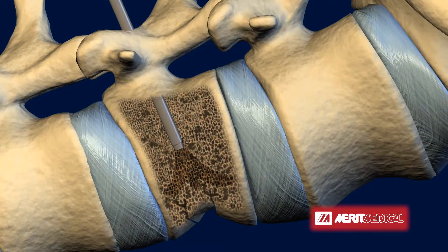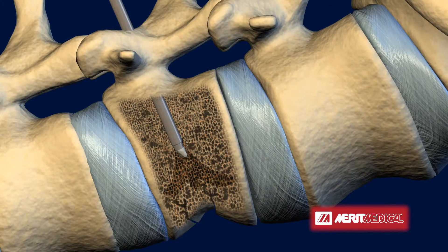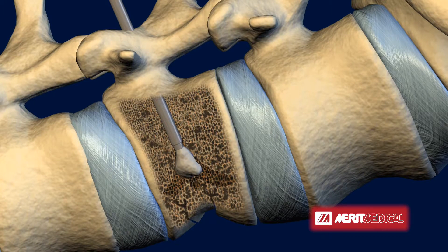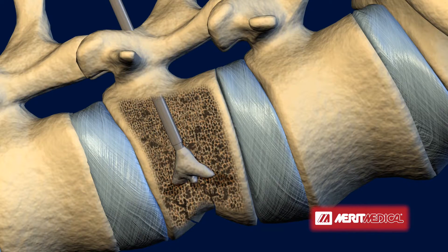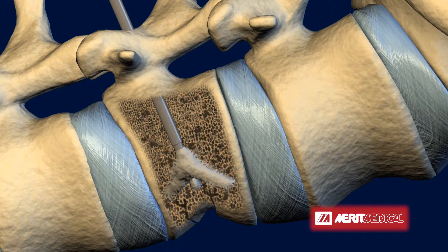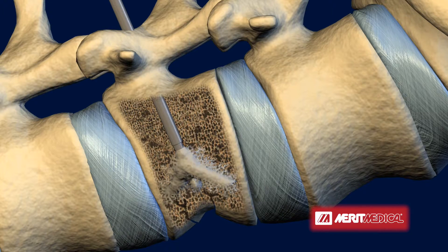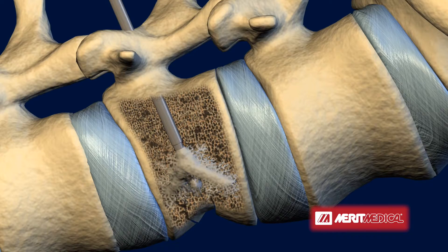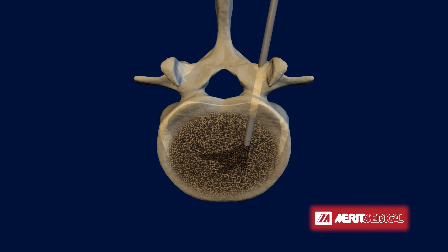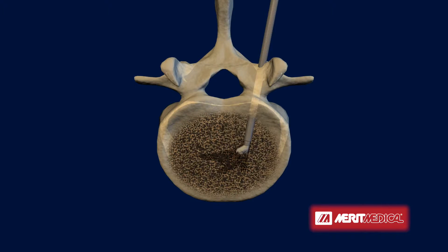Using a remote control hand switch, which permits cement delivery from up to 10 feet away from the radiation source, the physician delivers ultra-high viscosity bone cement into the vertebral body at a controlled rate. The cement preferentially fills the pathways created by the navigational midline osteotome and then interdigitates into the adjacent intact cancellous bone. This targeted cement delivery optimally stabilizes the fracture and eliminates pain.